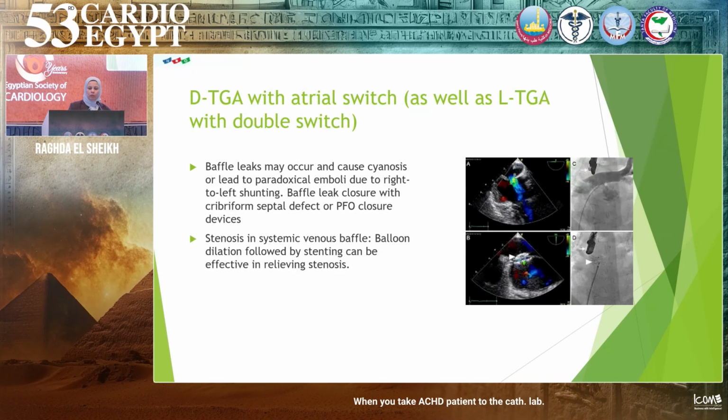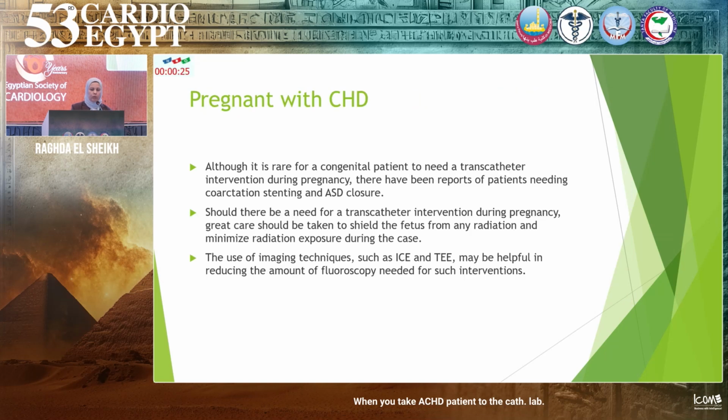In some cases of DTGA also, we have two types of switch, and we have baffles, which sometimes come with a complication, baffle leak or baffle stenosis. We can dilate the baffle stenosis using a balloon, and we can close the baffle leak also using a PFO device.